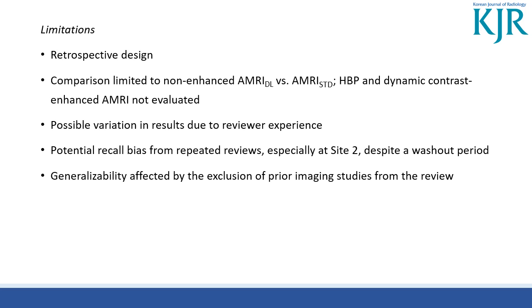Additionally, excluding lesions smaller than 4 mm may limit applicability in screening or surveillance settings. Recall bias is also a potential concern, especially at Site 2, despite a washout period. Finally, the exclusion of prior imaging deviates from clinical practice, which may affect generalizability.